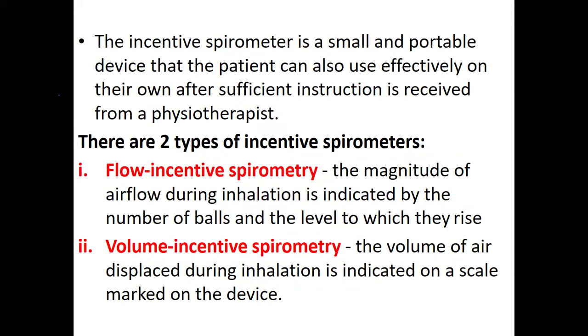The incentive spirometer is a small and portable device that the patient can also use effectively on their own after sufficient instructions are received. Meaning you can do this technique on the patient and teach them how to do it at home. They can even purchase this small device and continue with the techniques at home.